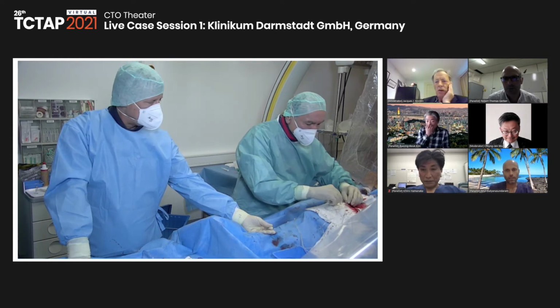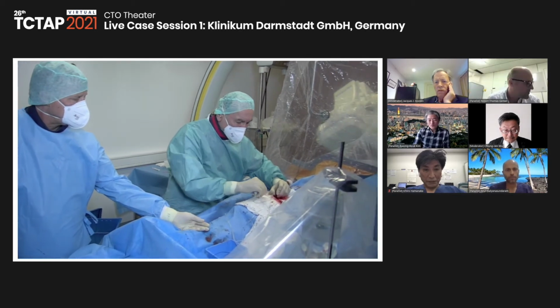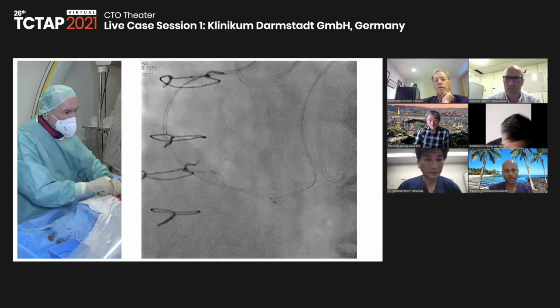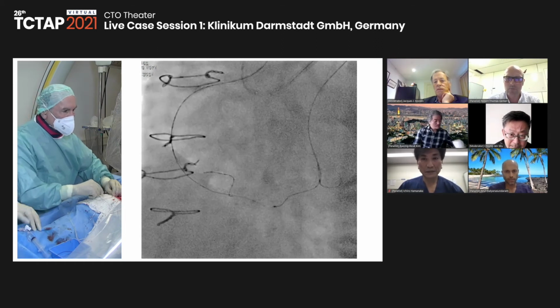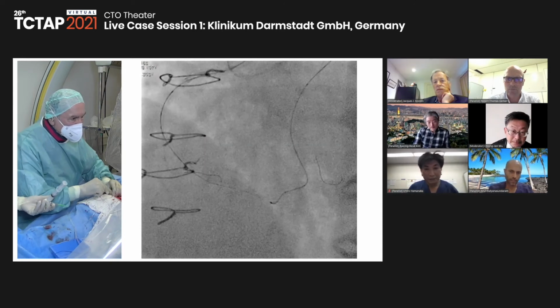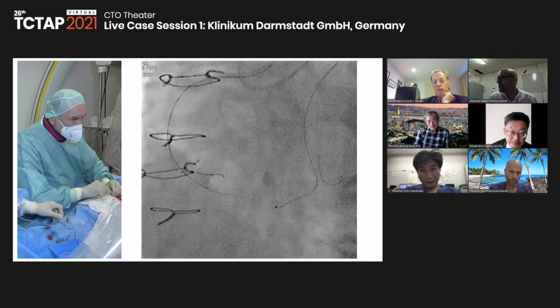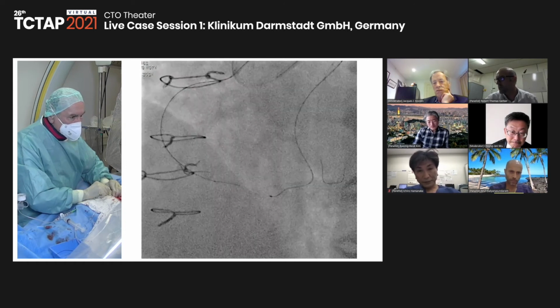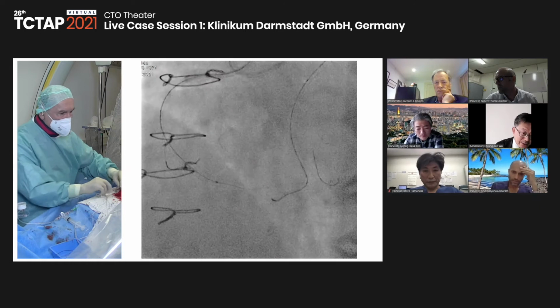You're using a very small balloon, I understood, Gerald? Yeah. The Terumo Ryujin 1.0 is one of my favorites. 1.0 by 5? Exactly, 1.0 by 5. So let's see. The Fine Cross went down easily, so the Ryujin should not have too much of a problem. Yeah, it's tracking pretty well. Start dilating. This balloon can tolerate high pressure.